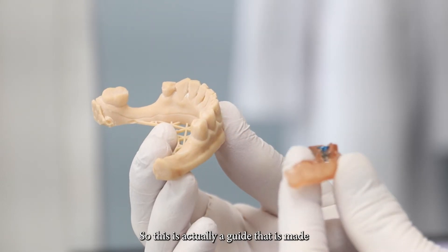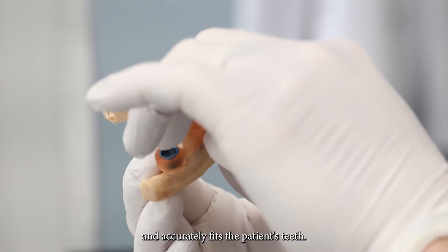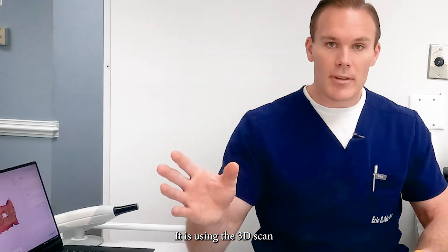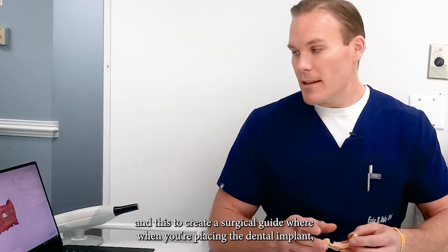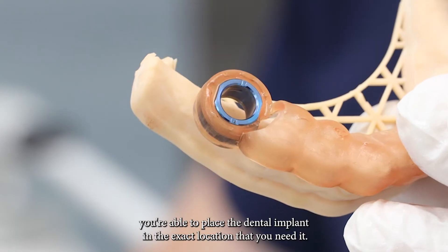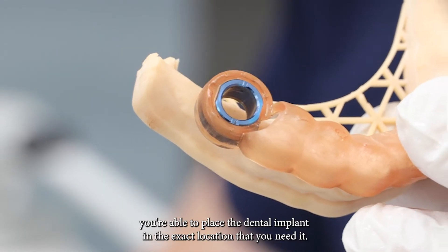This is actually a guide that is made and accurately fits the patient's teeth. It uses the 3D scan to create a surgical guide so that when you're placing the dental implant, you're able to place it in the exact location that you need.